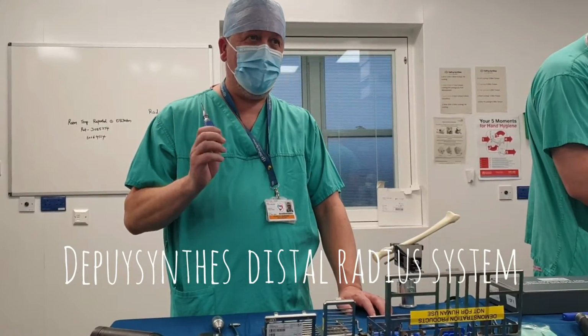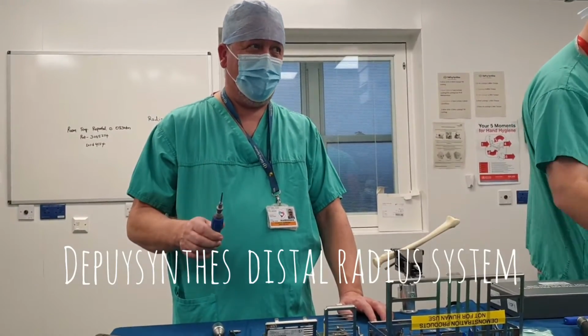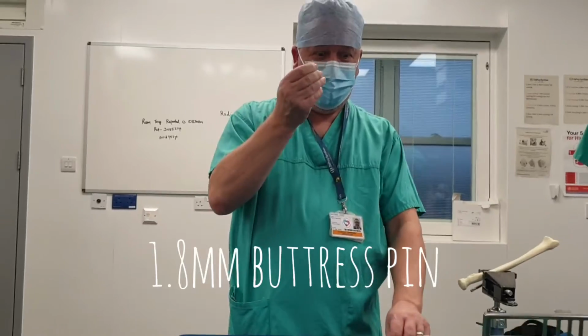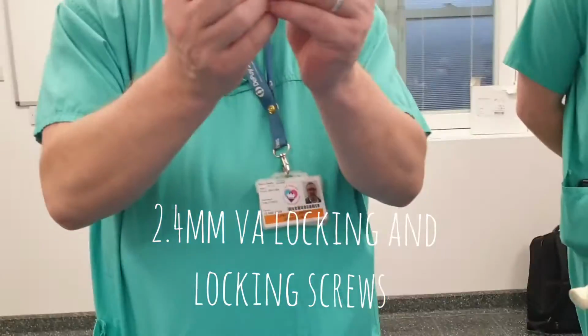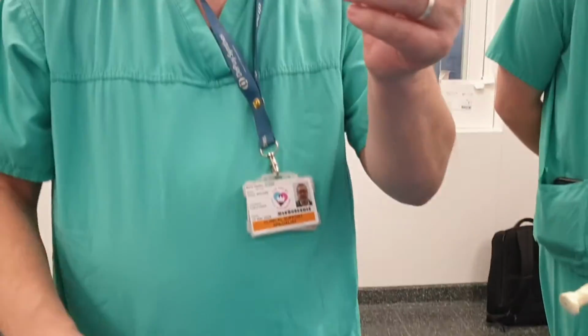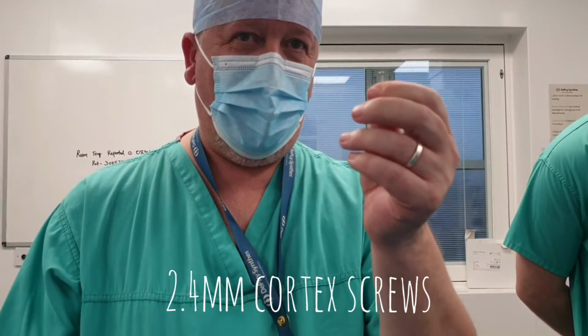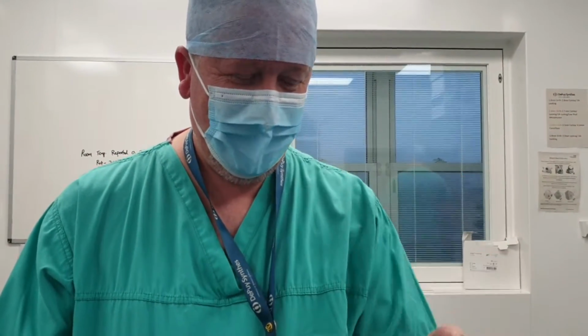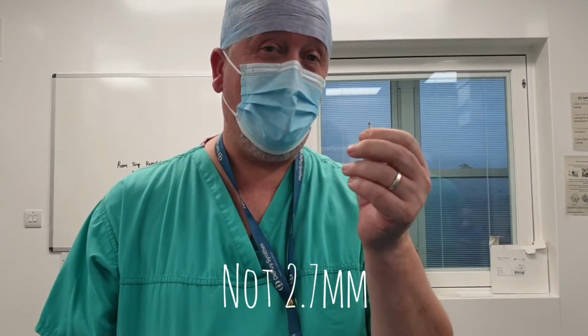We've been using a Depuy Synthes 2.4 distal radius system. So that is a 2.4 locking screw and, most importantly, a 2.4 Cortex screw. Not 2.7, 2.4. Their system is really easy, understandable.